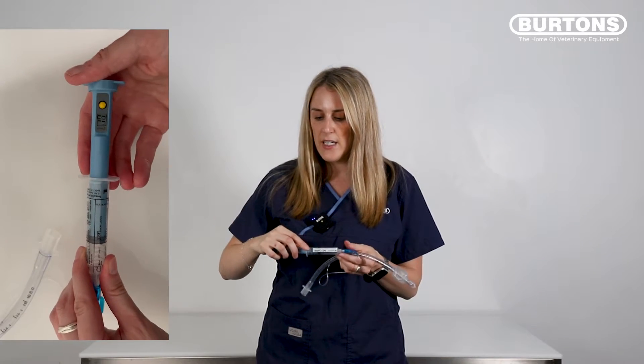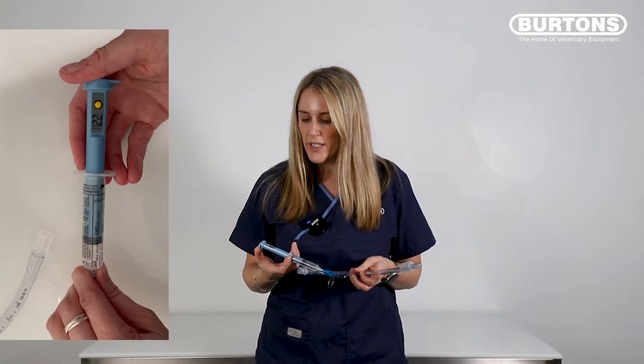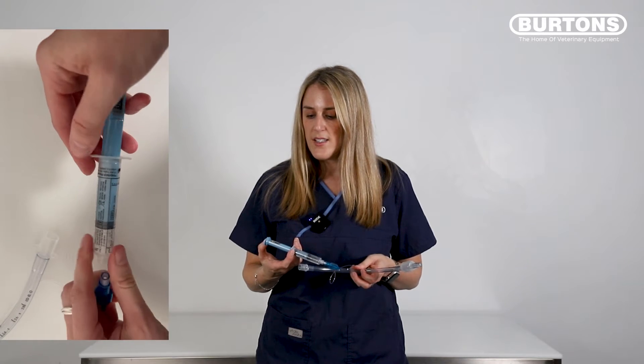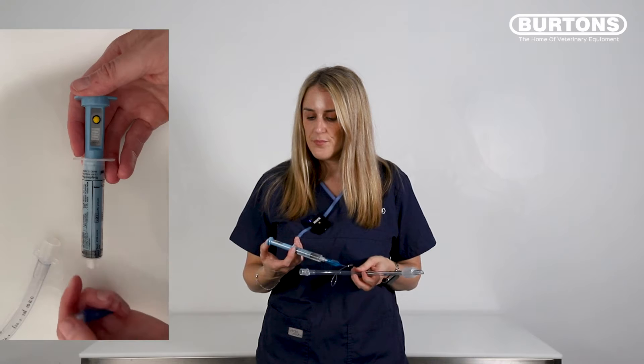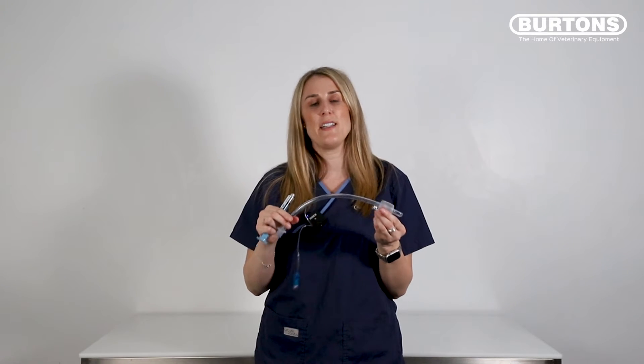Then we just start to inflate that cuff while looking at the pressure, and I'm going to stop when I get to about 20 centimeters of water. Then I just unattach and our cuff is now safely inflated in our patient.